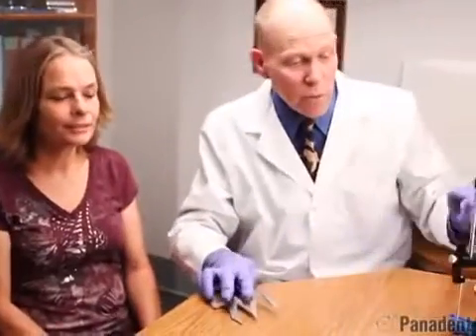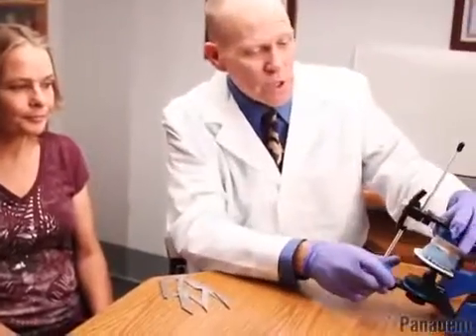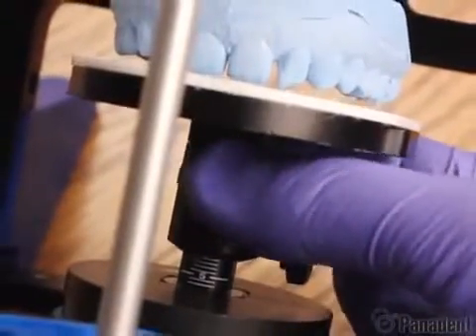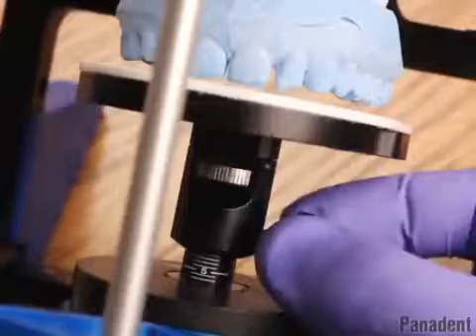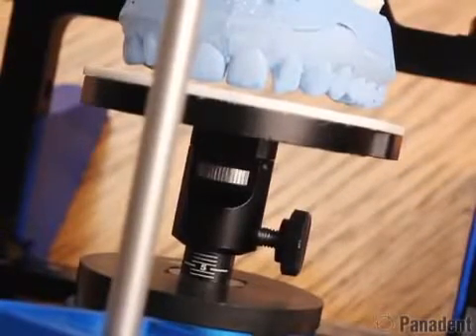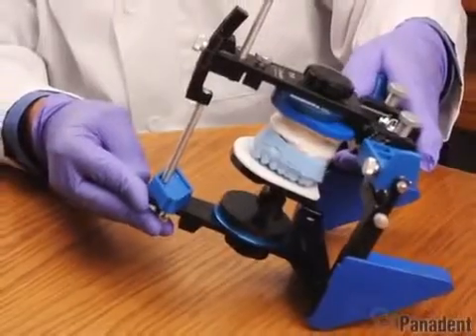We can see the incisal edge is short, maybe a half a millimeter to maybe a millimeter, if that. If we want to add a millimeter length to our central incisor, we can come to the articulator. We have the Kois adjustable platform. We can adjust this down 1 millimeter using the scale on the housing. And this now gives a guide to the technician of adding 1 millimeter length to the central incisors.